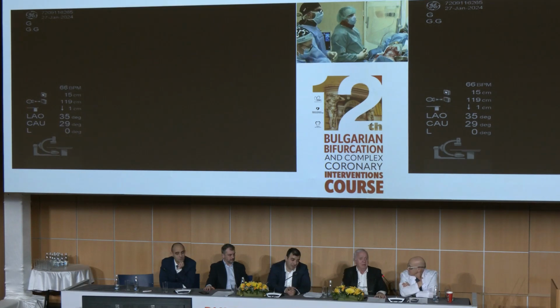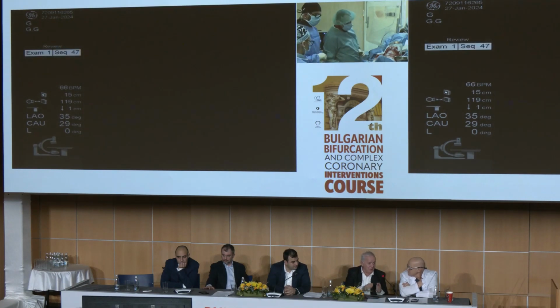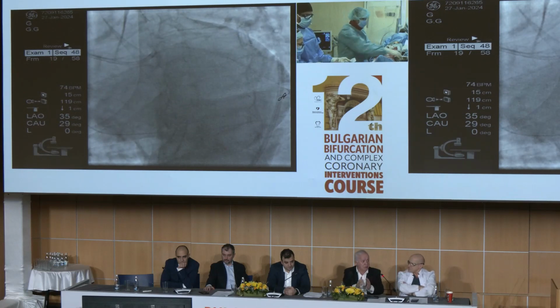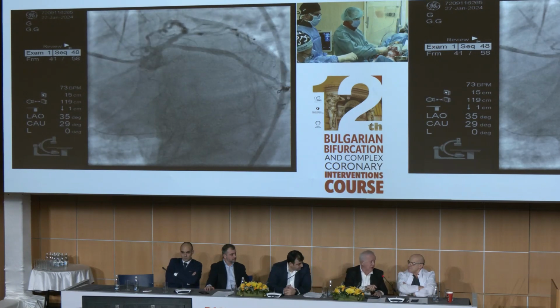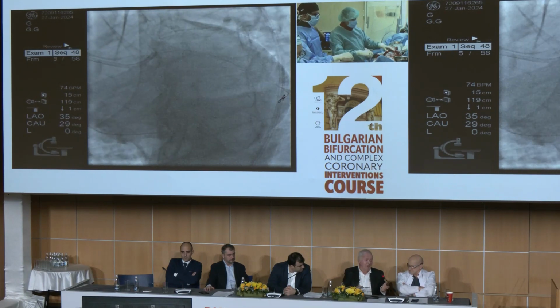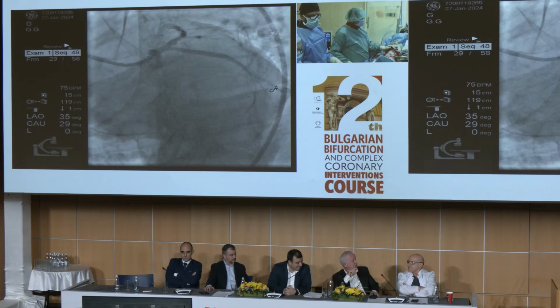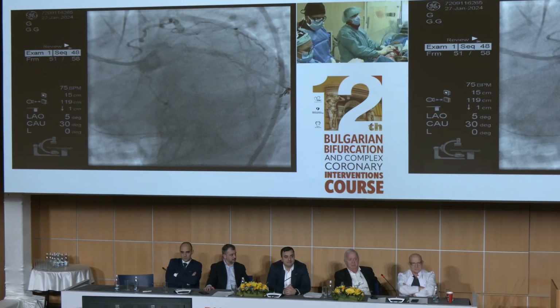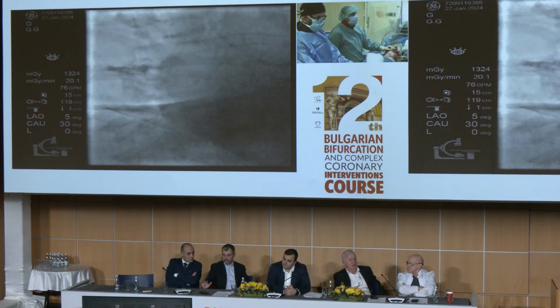And the good news is that the trial was done again by a Korean group that randomized OCT and IVUS to QCA guidance, and the trial is bigger than October, and the result is absolutely no difference. NS, nothing. It's not published yet. It was presented only in Amsterdam. 1,300 patients randomized, more than October.